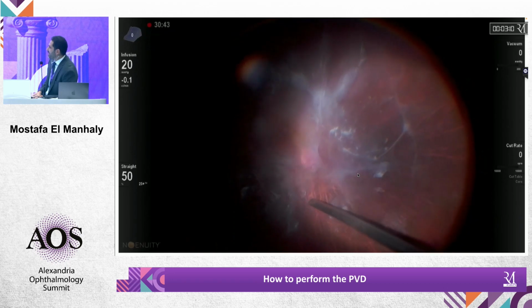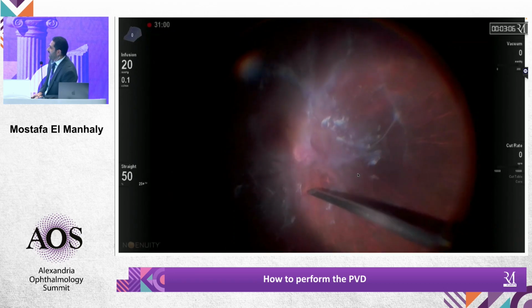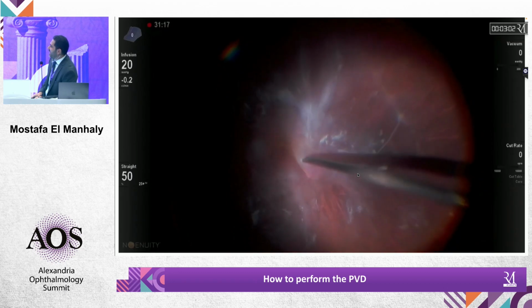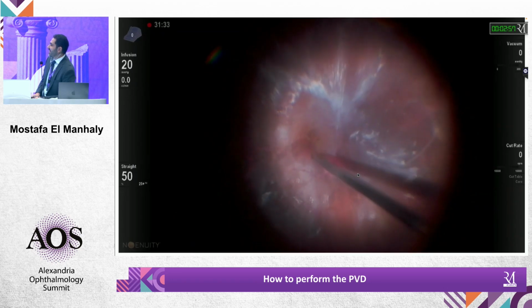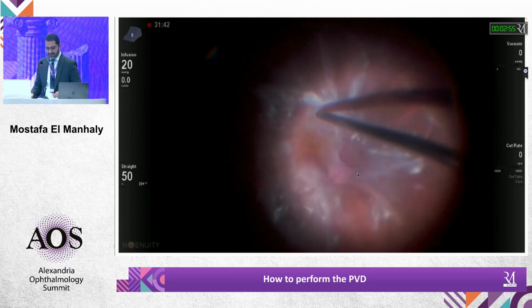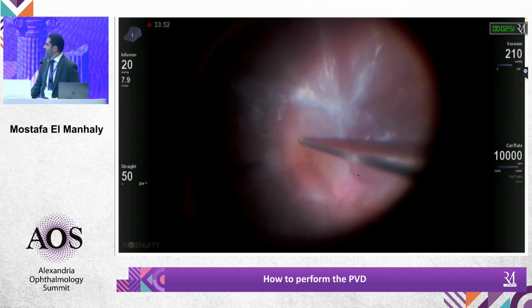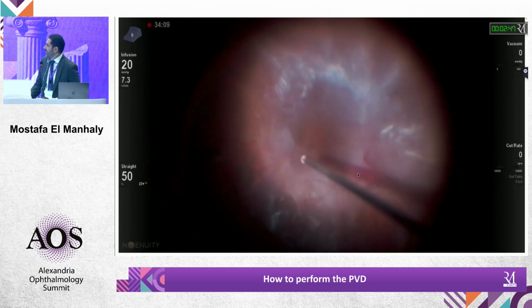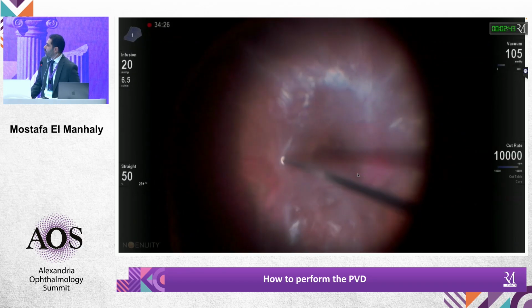Okay. So I was lucky. Dr. Hassan, please. I will do just as you have done. If this is your video, it's very nice. Yes, it's mine. I would start from the center to the periphery. It is always possible to find a cleavage plane when you start from the center to the periphery. But it is much more difficult to find the plane when you start from the periphery to the center. Okay, so I think this is the approach in such a case.